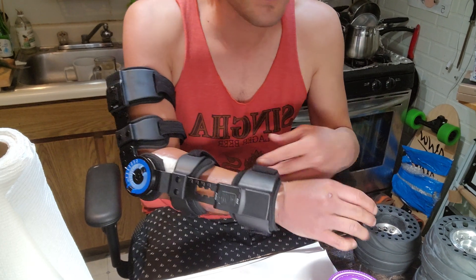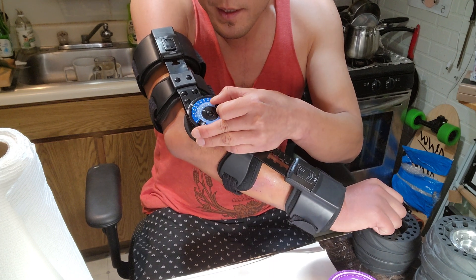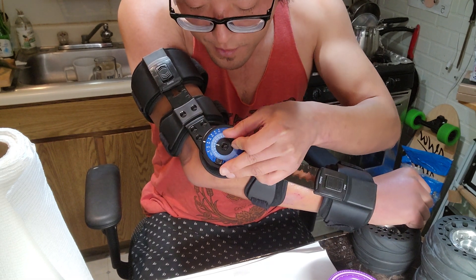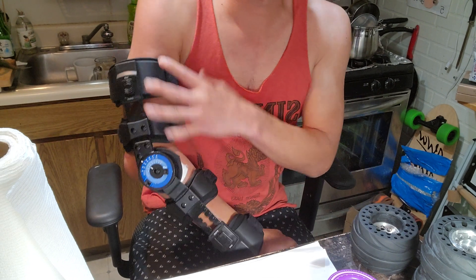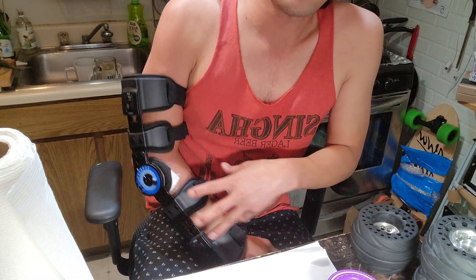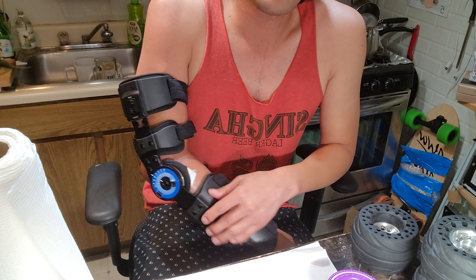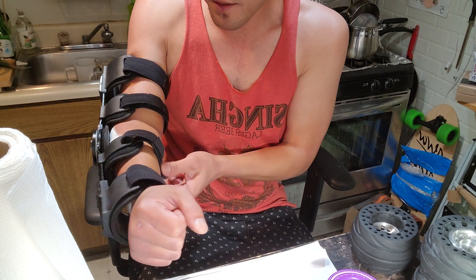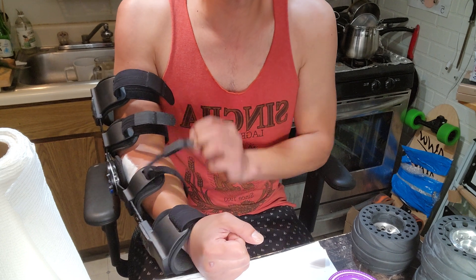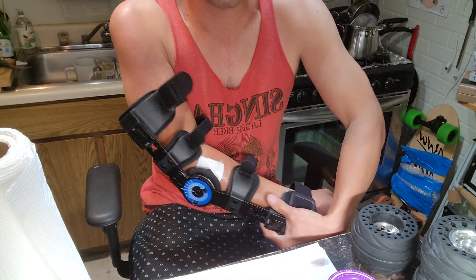With a splint, the hospital gave me something I had to wrap around and put on a sling. This is great because I can use these little pop-up dials to set it — right now I have it set at 30 degrees so my arm won't move at all, especially when I sleep. It's better than a splint or cast because as your bone fuses you want to be able to exercise it, and this allows you to take it off if you need to shower. I can literally set my arm at a certain angle or have a range of motion.